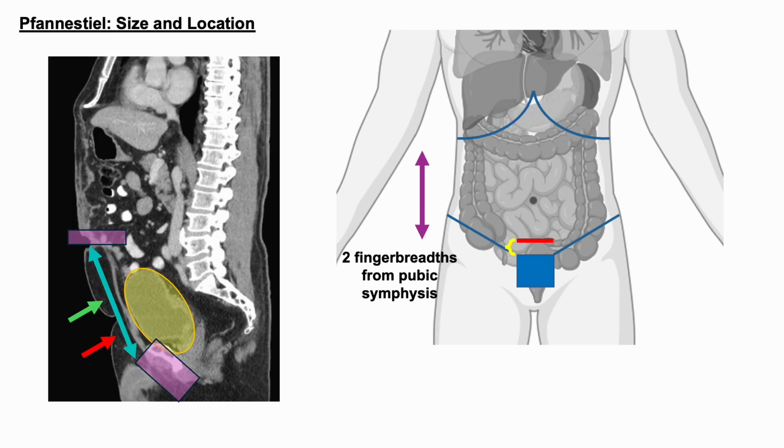Now, in your own practice, there are several things you can do for preoperative planning to help you navigate this. The most obvious one, which I've shown here, is to look at a CT scan. The sagittal view shows the anatomy best, and you can map things out that way. However, you should look at the patient chart for any evidence of BPH or medications related, such as Flomax or doxazosin. And in the OR, there can oftentimes be clues if it's been undiagnosed BPH.